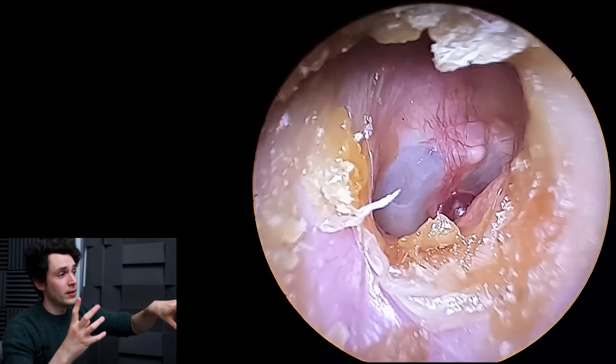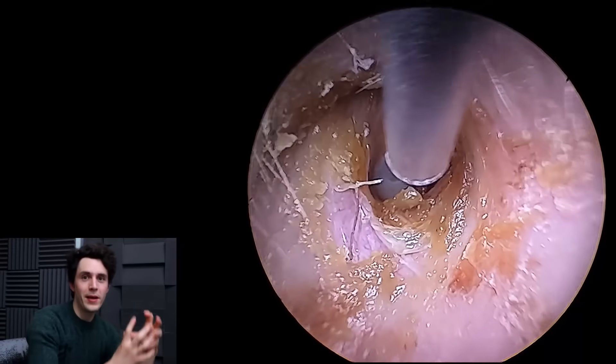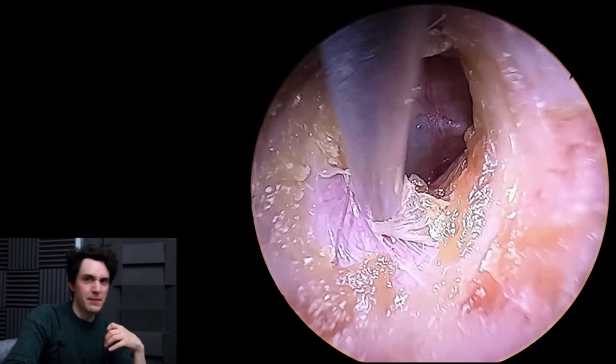Capillaries have ruptured and now we have blood pooling in the tissues. Instead of bruises all over the shop, it's just formed this perfect orb basically on the drum. So I'm calling it a hemorrhagic bleb, but you can call it a hematoma as well.